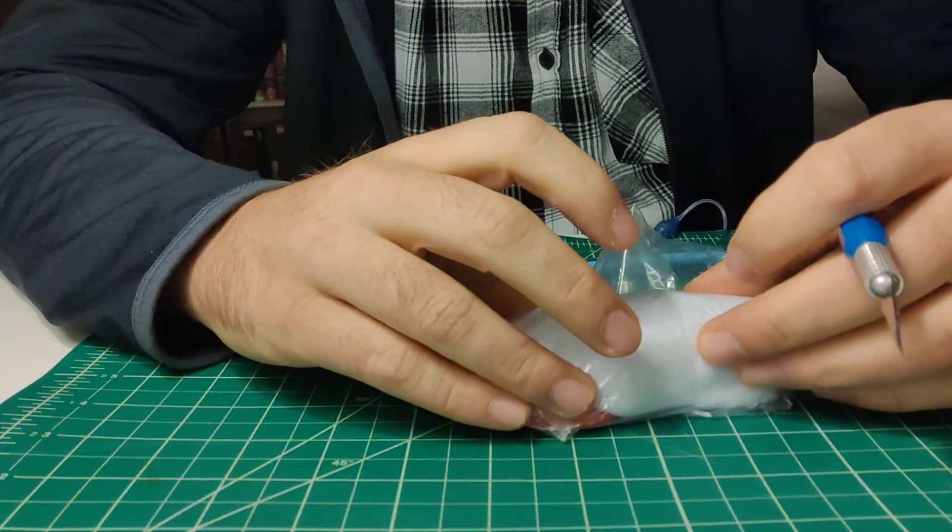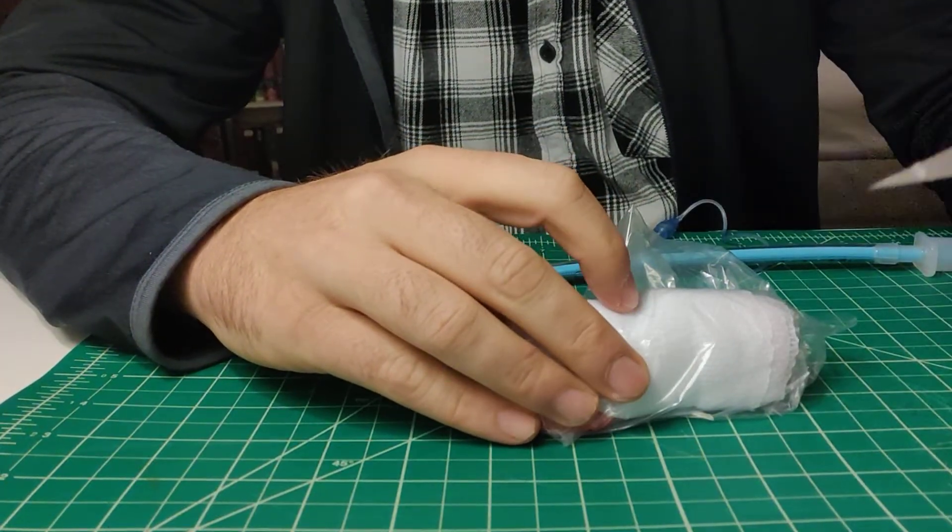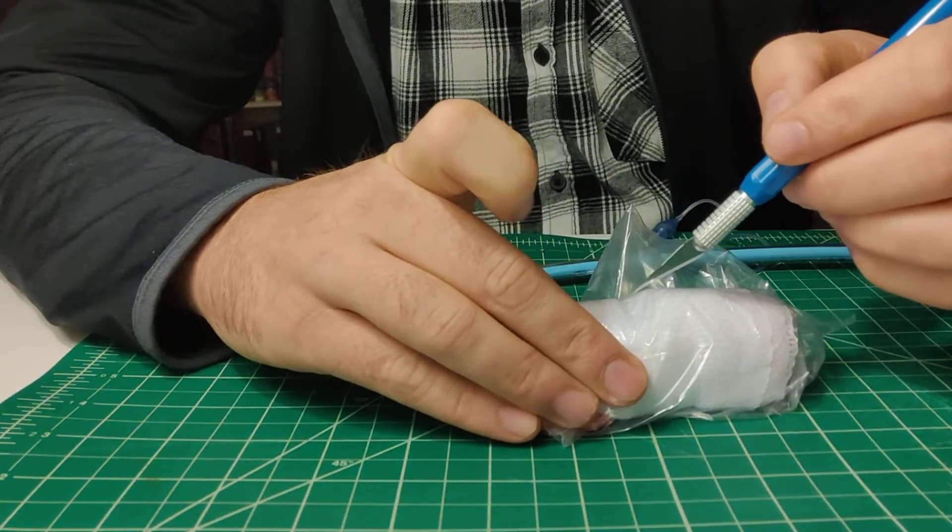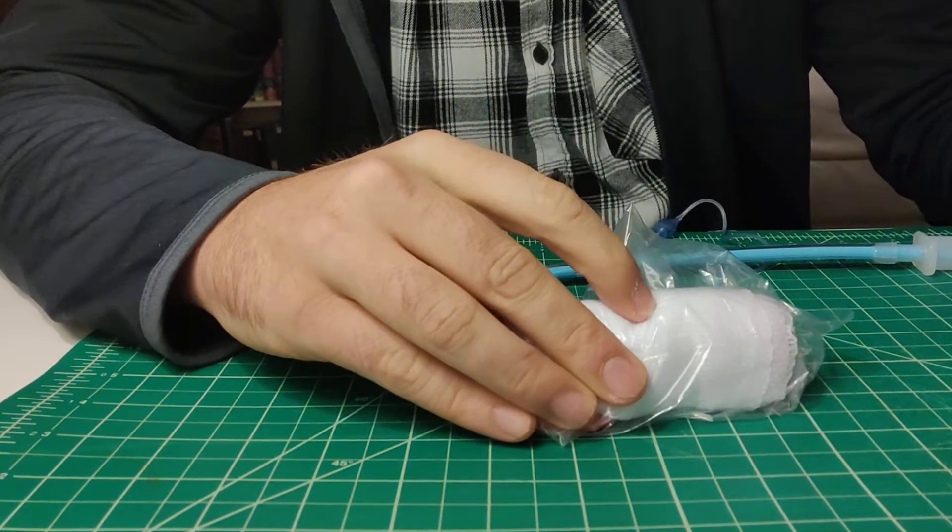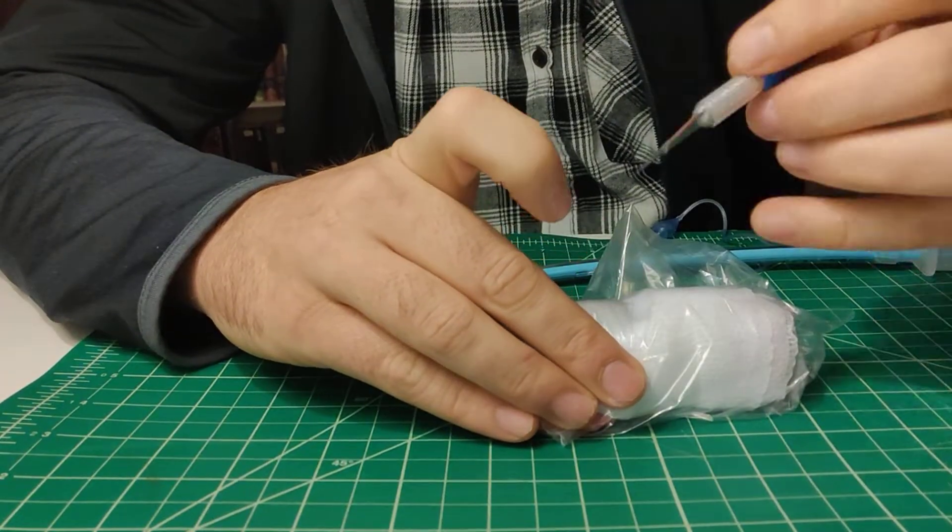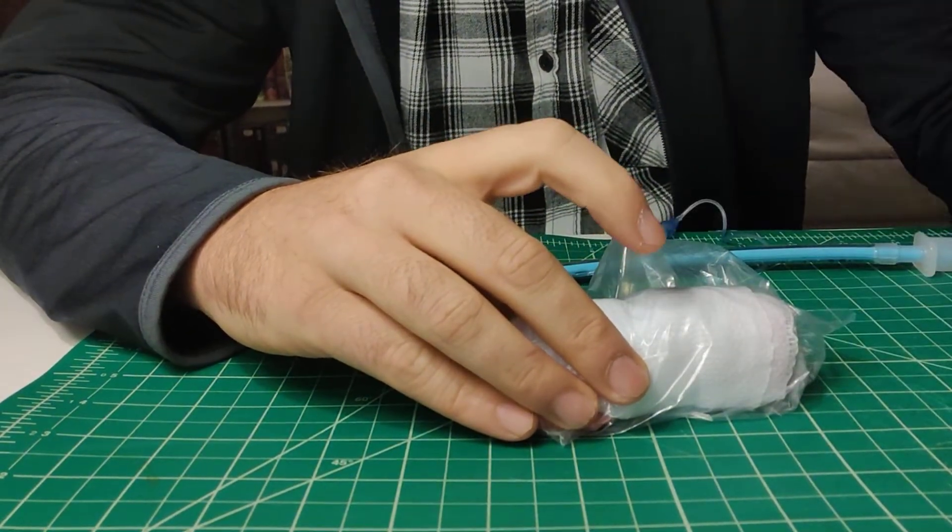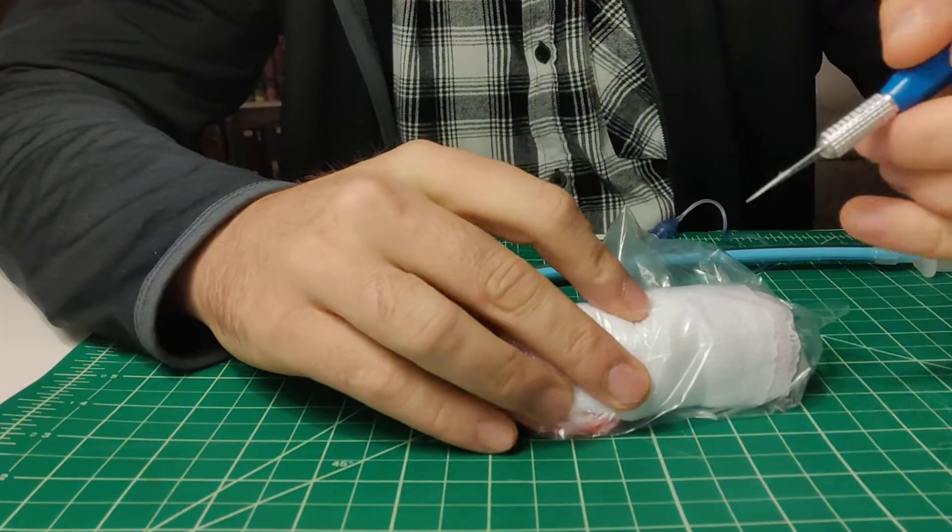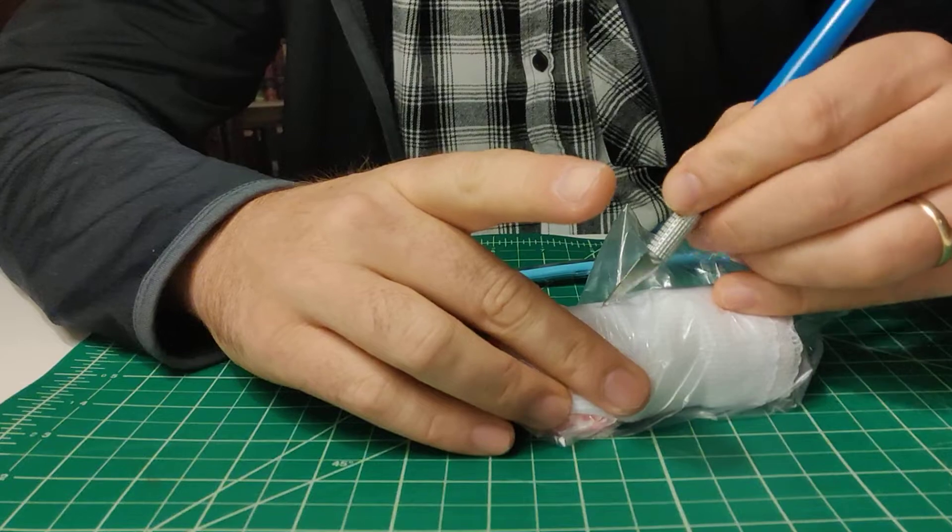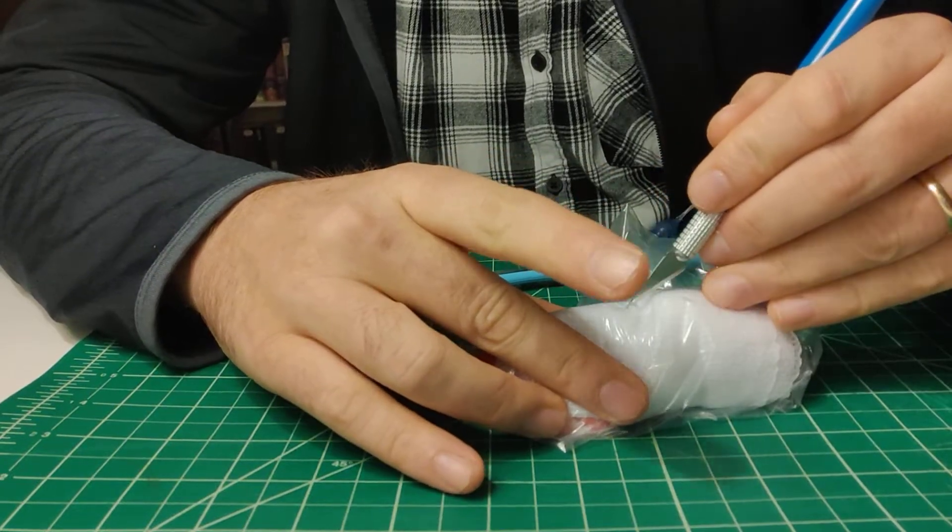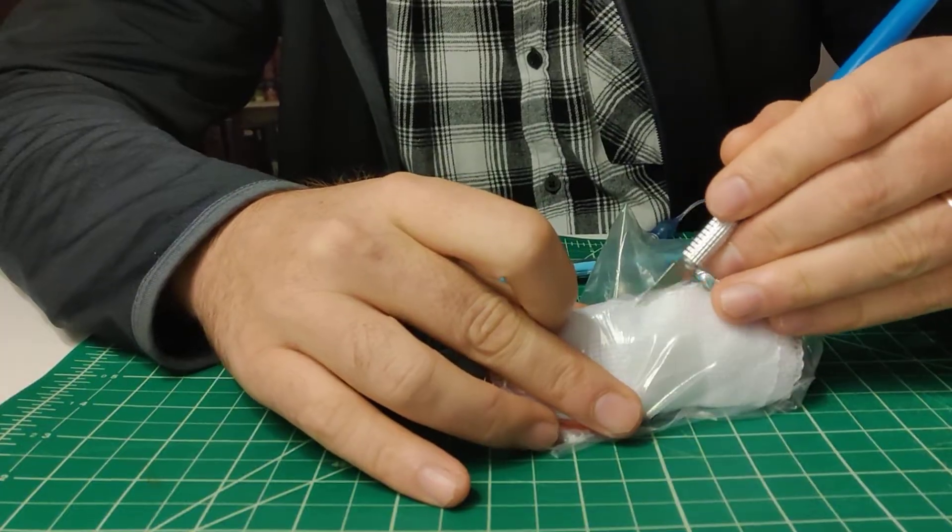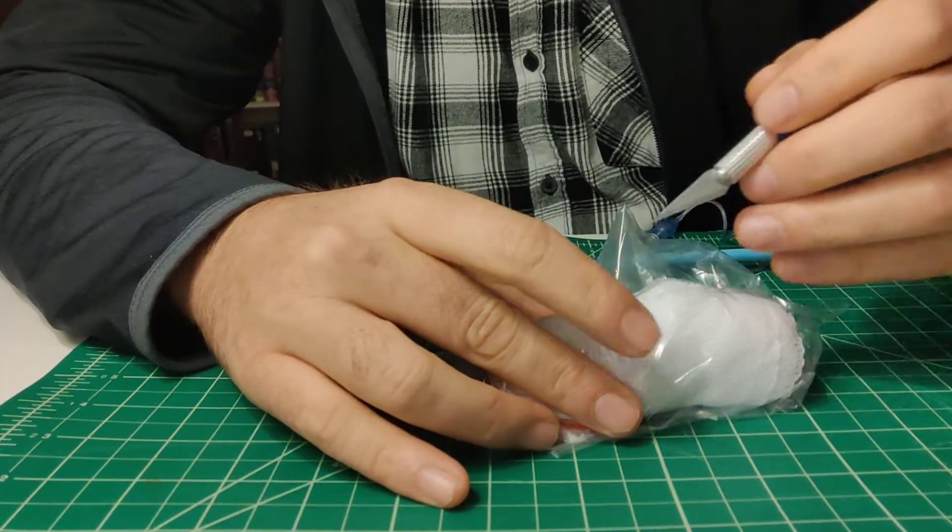The way you do this is, and this is why it's important to practice. So when your blade goes onto the field, your finger retracts. When the blade goes away, your finger goes back in. This is especially important. Once you puncture the cricothyroid, the temptation is while your blade's in there to start feeling, but don't do that. That's where I cut my finger. Okay. So if you can palpate your landmarks, you go right above the cricothyroid and you make a nice aggressive incision. Don't be afraid about pushing, really get in there and cut that and do like a two inch incision.